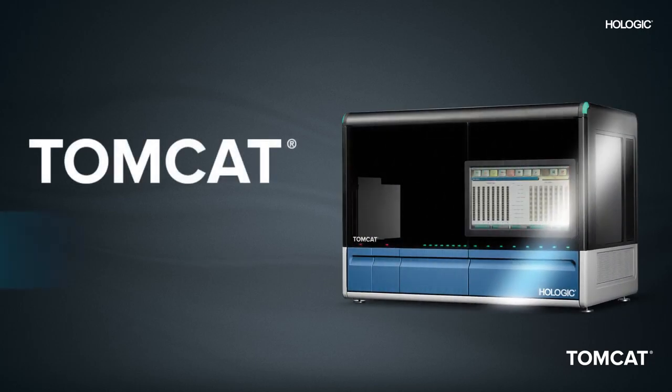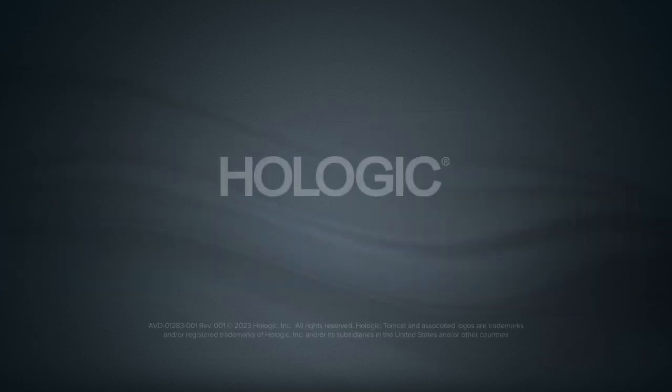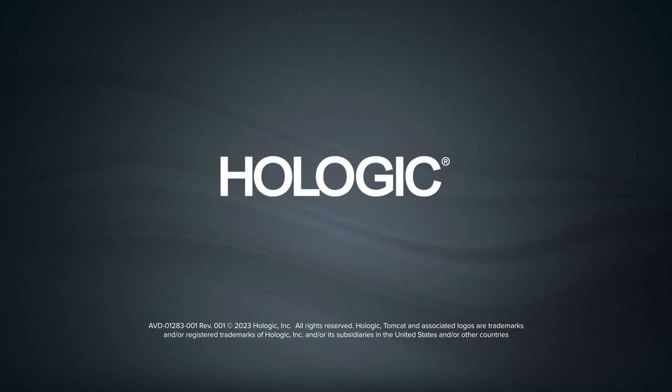By choosing the Tomcat instrument, you're gaining a high-throughput, fully automated pre-analytical instrument that allows you to do more with less by reducing operator hands-on time and allowing for more efficient use of skilled labor. The Tomcat instrument from Hologic: enhancing automation for molecular testing.